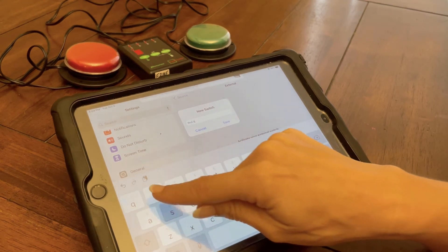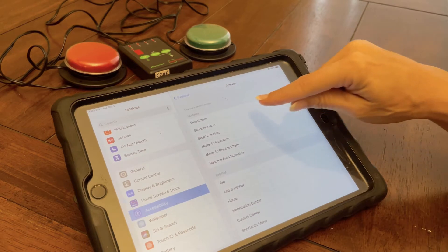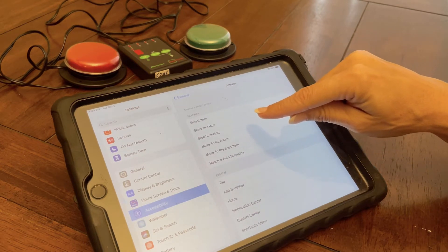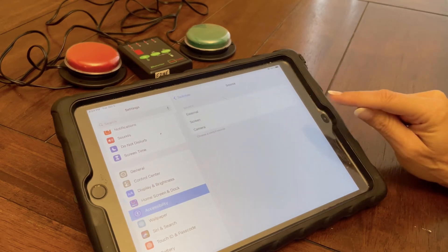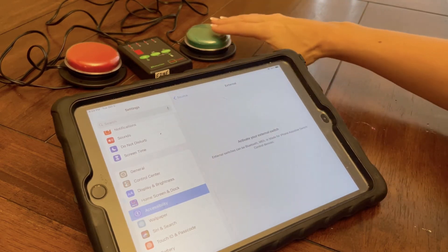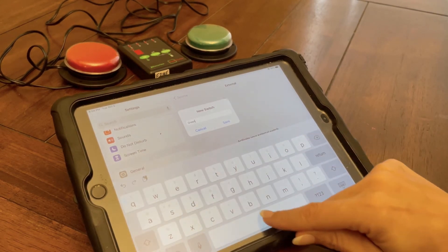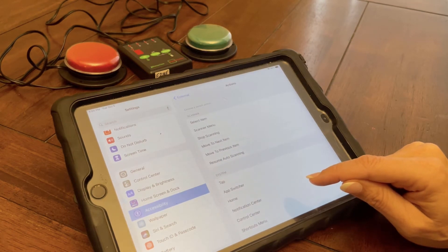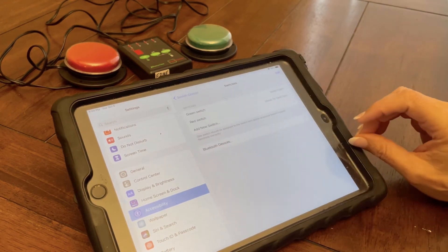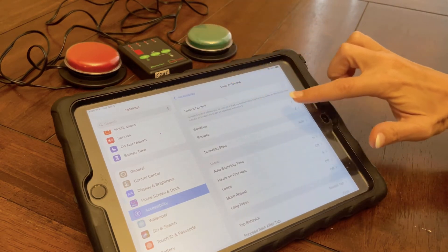Red switch. Maybe I want this to be move to the next item. And then maybe I want this one to be an external switch.